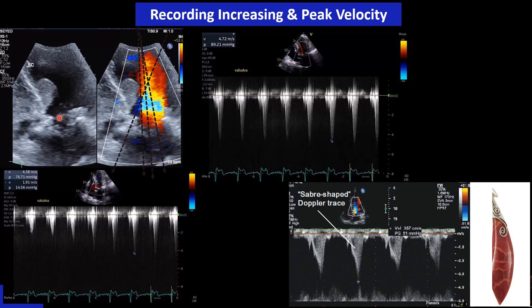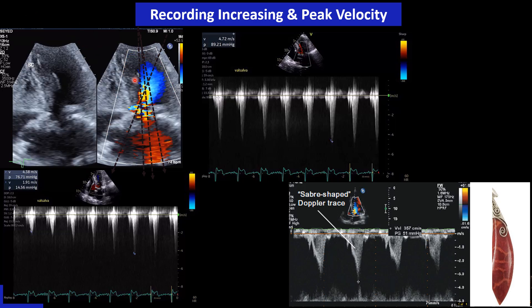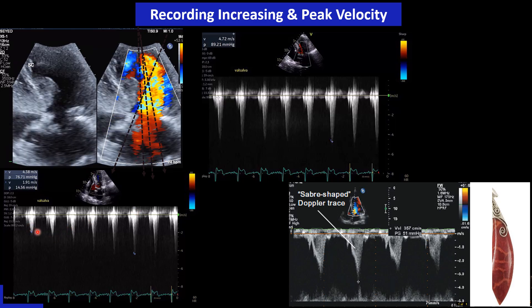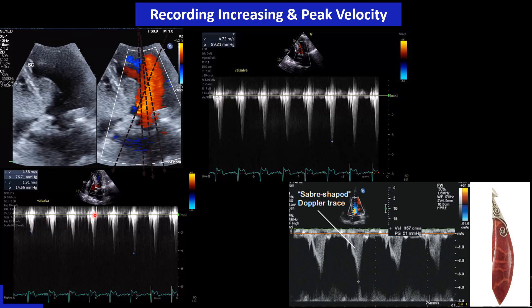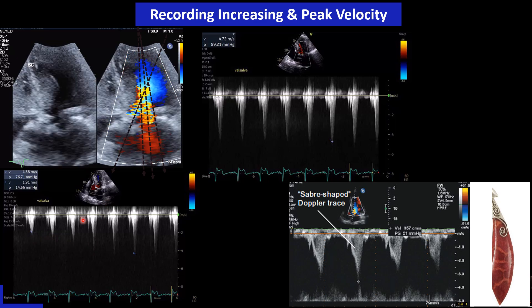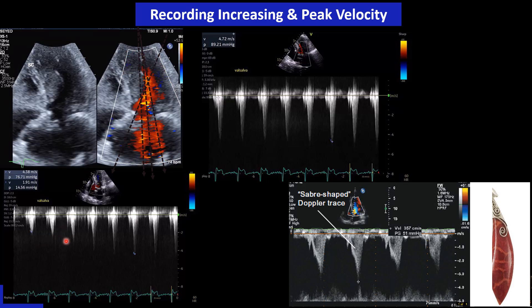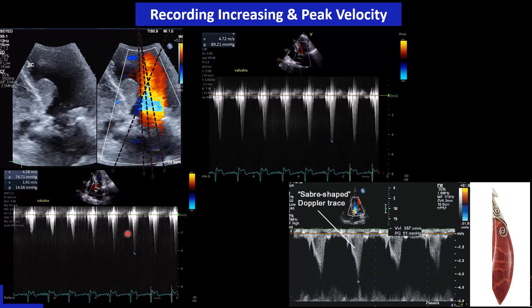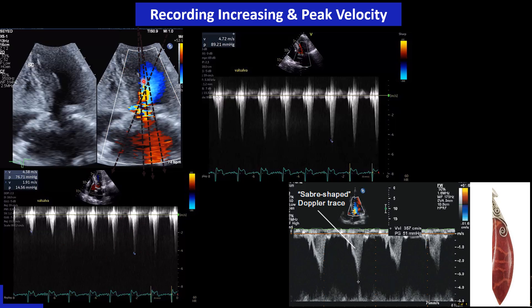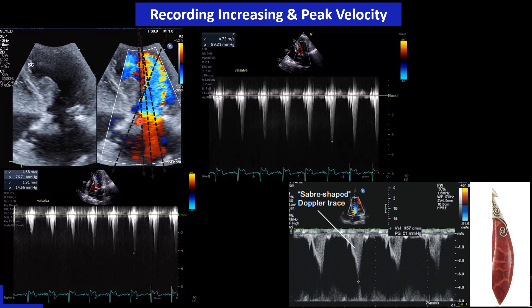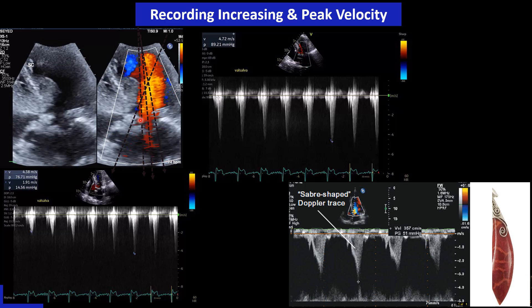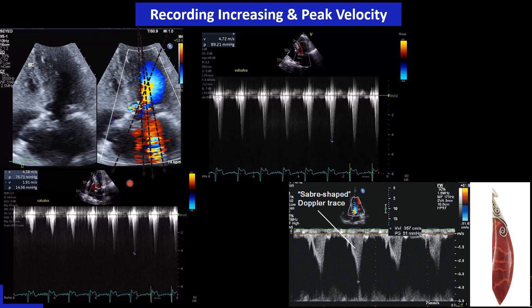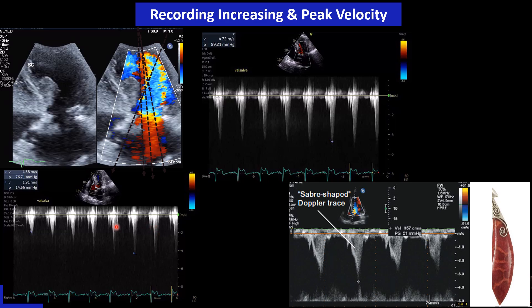We then ask the patient to perform Valsalva and record on CW Doppler. The pressure increases little by little to maximum. Sometimes we lose the view during Valsalva — if that happens, we adjust by tilting the probe tip anteriorly or posteriorly (toward the roof or floor) gently to find where the velocity increases.